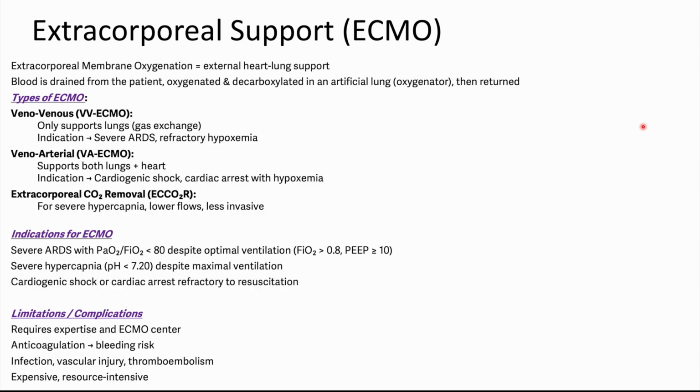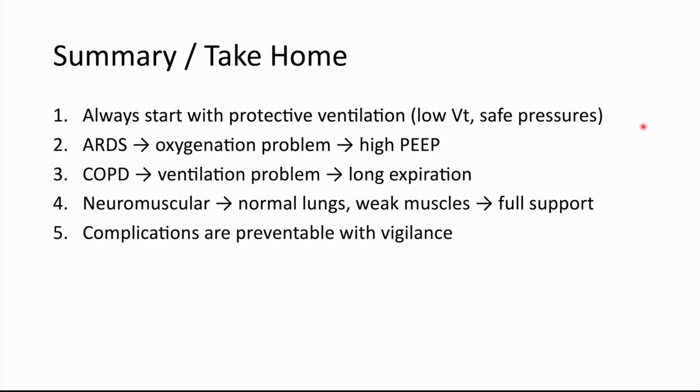So finally, to summarize, mechanical ventilation supports life but must be tailored to disease. ARDS, oxygenation problem: low tidal volume, high PEEP, prone if needed. COPD, ventilation problem: long expiration, low rate, careful FiO₂.